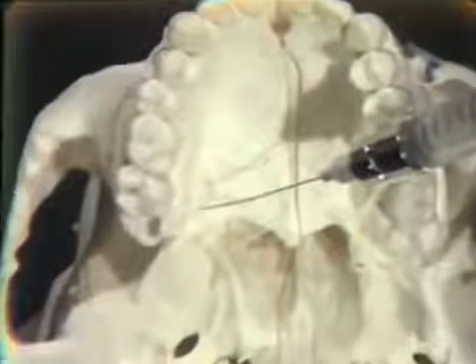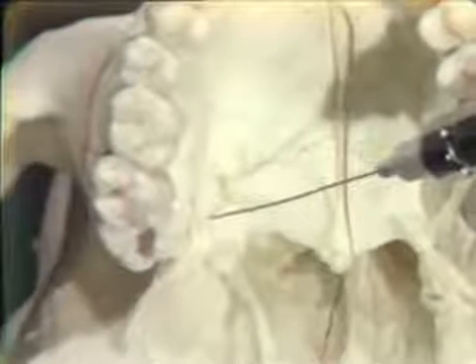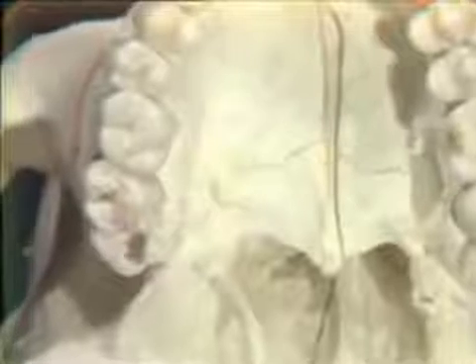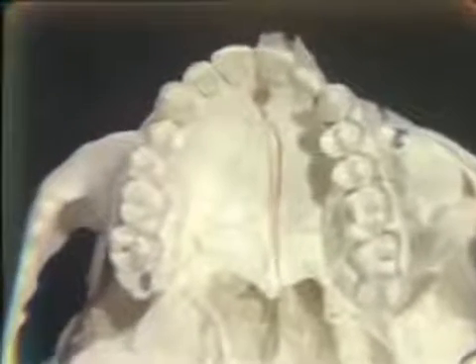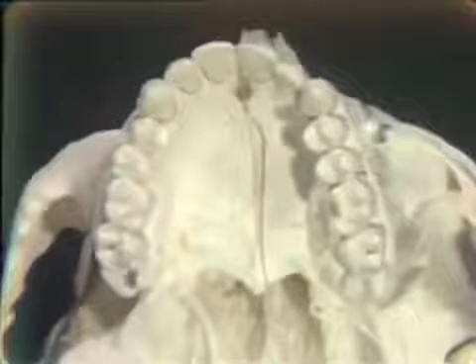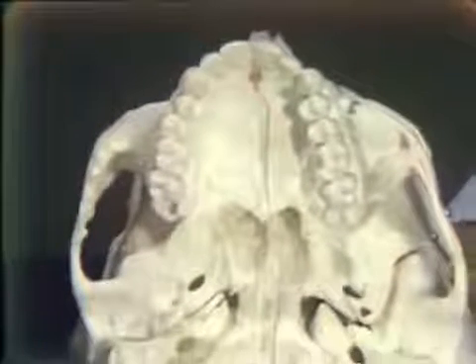Ideally from a quarter to a half cc of solution, if you can, inject it at this site. Now this will anesthetize, as we said before, all of these palatal soft tissues from third molar to cuspid, which would be advantageous, for instance, if you're going to remove a quadrant of teeth and manipulate all of these palatal soft tissues from third molar to cuspid.